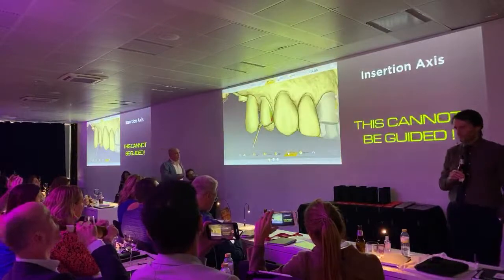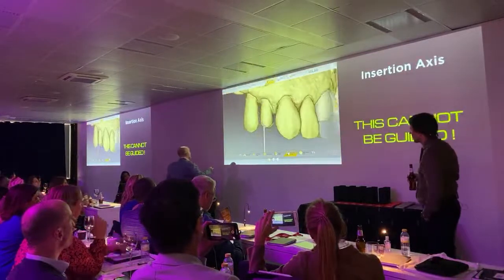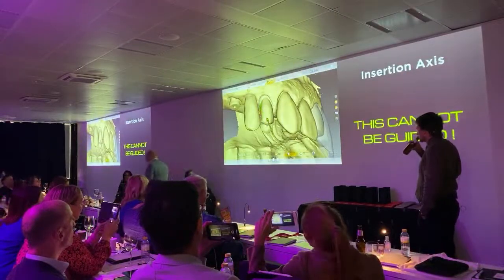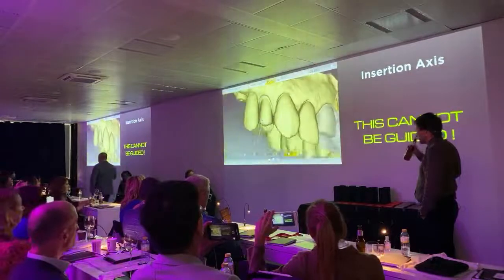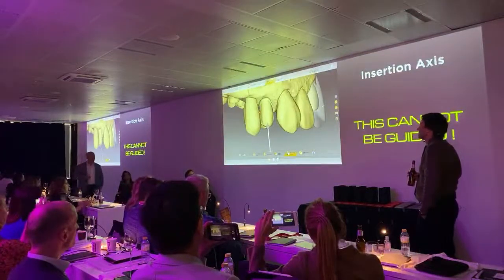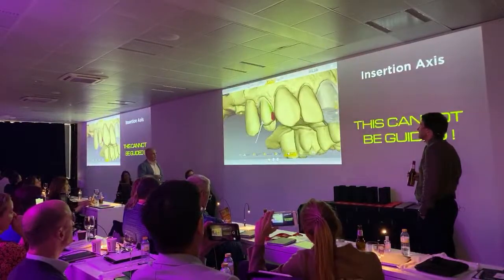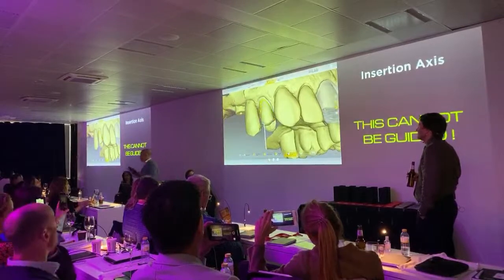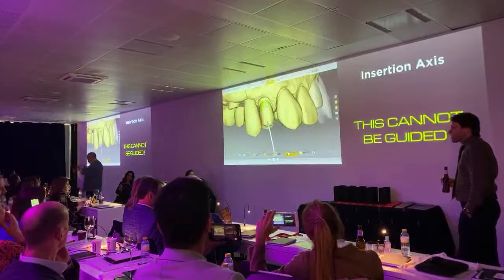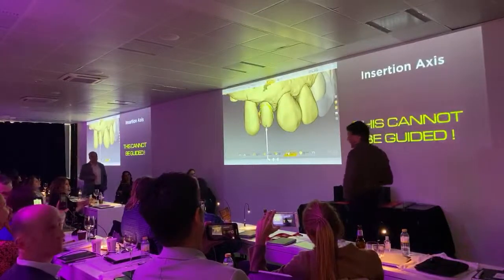The most common problem is the insertion axis. Look at this. It's impossible to find a way to fit the restoration without opening the margins. And there's no guide for this. We cannot make anything to help you, because the guide is the screen of your scanner.